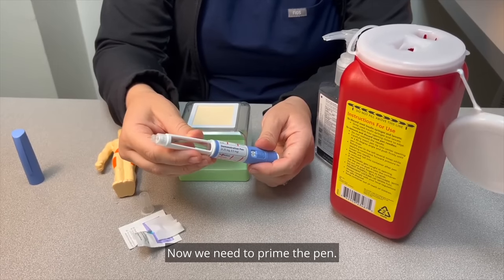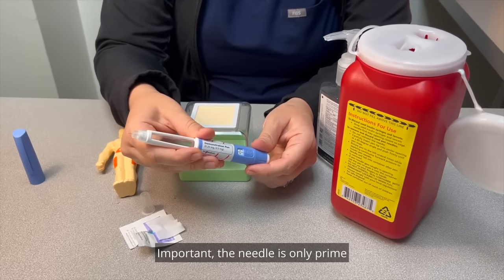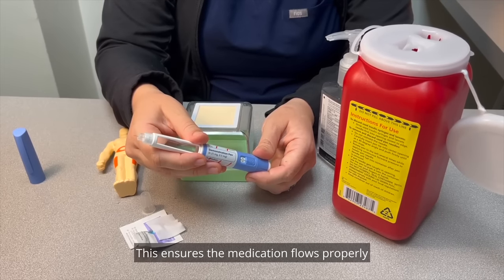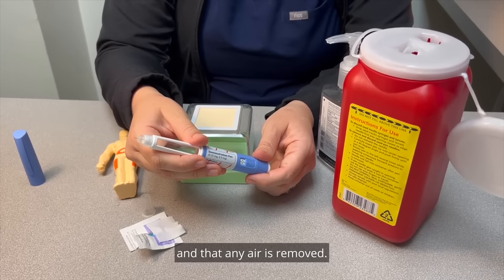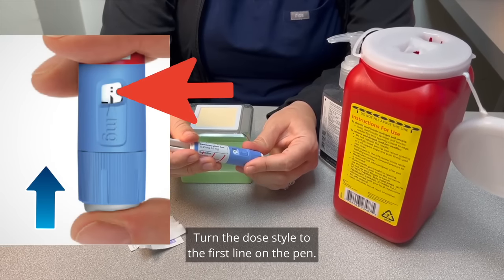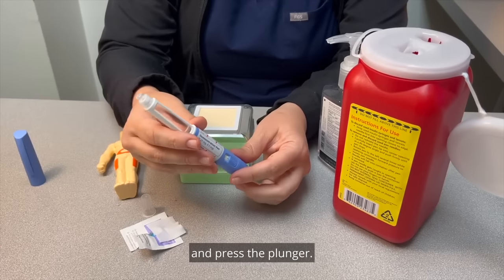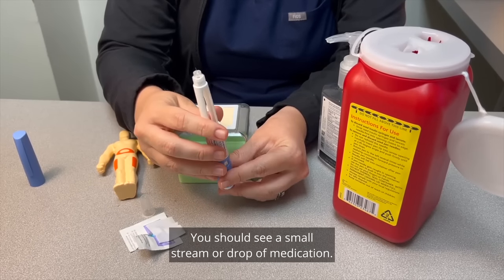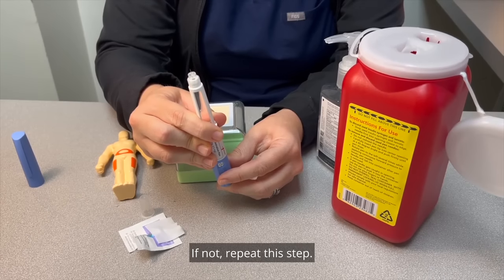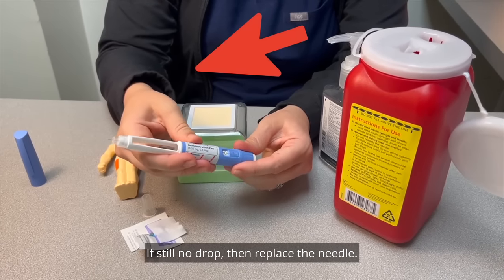Now we need to prime the pen. Important: the needle is only primed the first time you use the pen. This ensures the medication flows properly and that any air is removed. Turn the dose dial to the first line on the pen. Hold the pen with the needle pointing upwards and press the plunger. You should see a small stream or drop of medication. If not, repeat this step. If still no drop, then replace the needle.